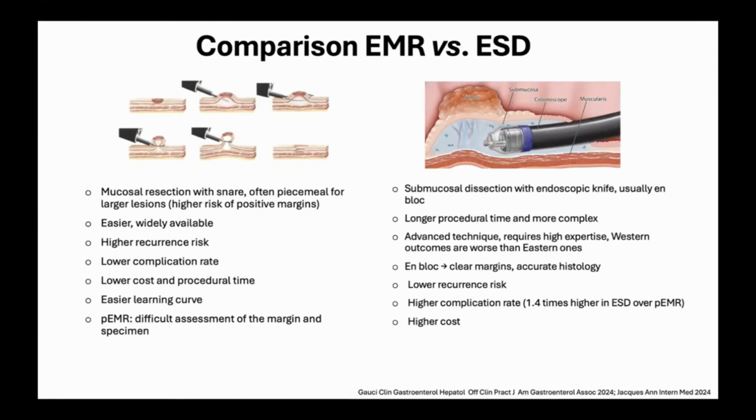And this is important. Saying that, the SMIC for this procedure, so the depth of invasion in Western countries, was about 4% to 6%. And in Japan, it's been much higher, between 11 and 21% risk of deep submucosal invasion. So where is the difference? I'll tell you what, we recently did a multicenter study with more than 3,000 ESDs in Europe, and the study was led by my team at the Royal Free Hospital.